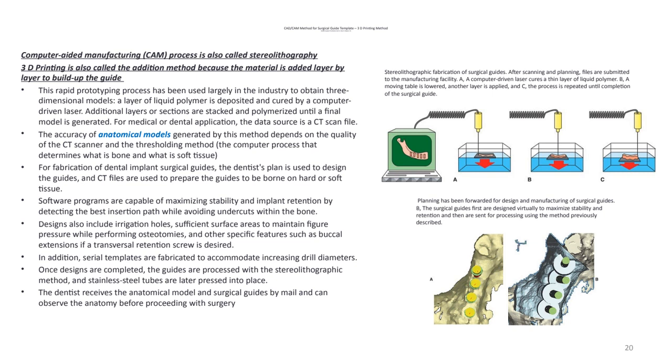So we cannot go ahead with the fabrication of the stent until we have the approval from the doctor. This is done via the computer software. It's an easy way of communicating with the doctor about the case, and it gives more control over the treatment plan and where the implant should be placed.